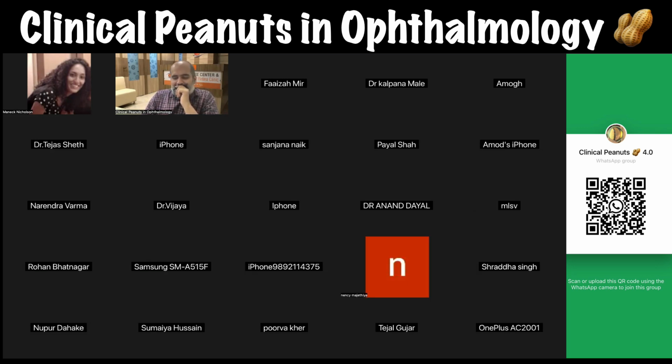But basically, the rule of thumb is just when there's regular astigmatism, you can go ahead. If it's stable, you can plan your toric lens. But again, you can't under promise, over deliver, because these corneas don't react to incisions and to surgery the way regular virgin corneas do. And therefore, a lot of surgeons I've seen, very senior surgeons, use these custom toric lenses as well to correct these cases.